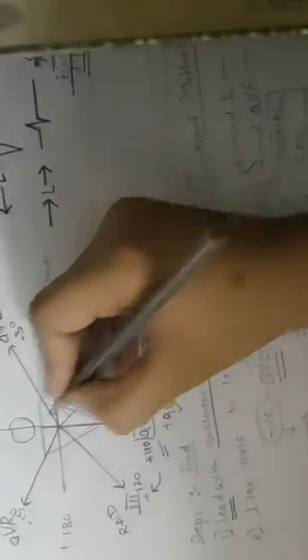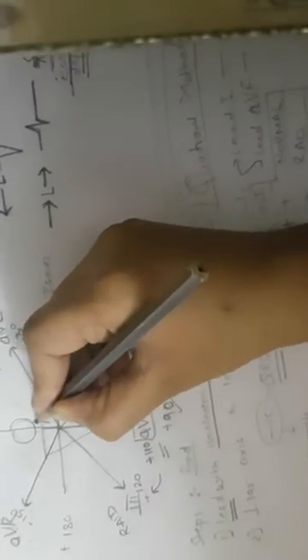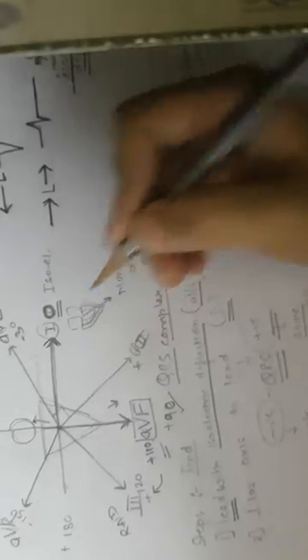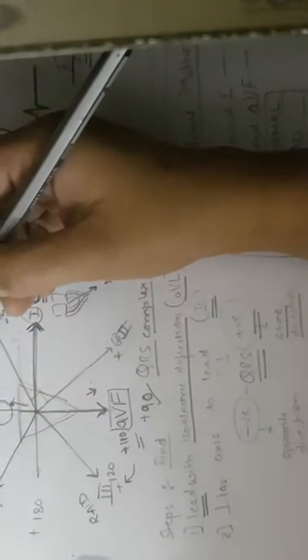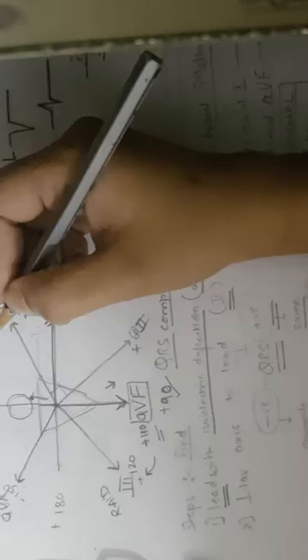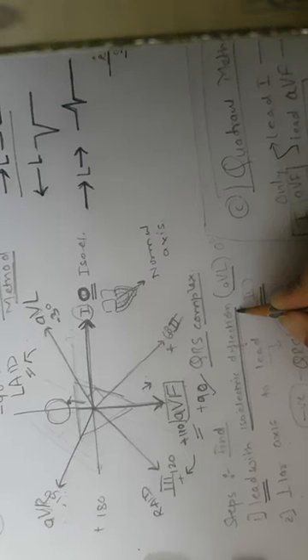If the current is moving away from AVF, the QRS complex is negative, then the current is moving in the opposite direction, which means there is left axis deviation. So first you find an isoelectric deflection lead, then you find the lead which is perpendicular to it.